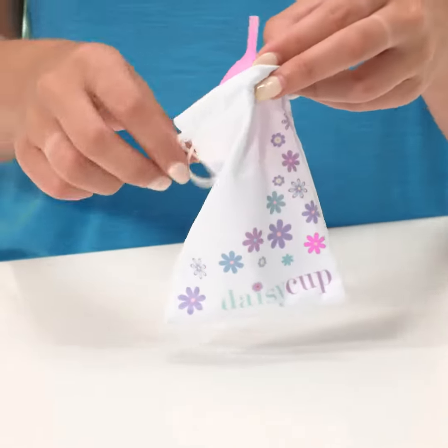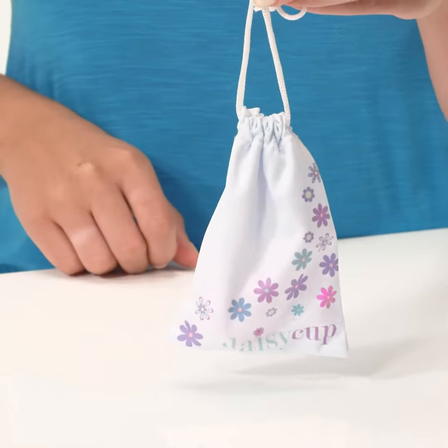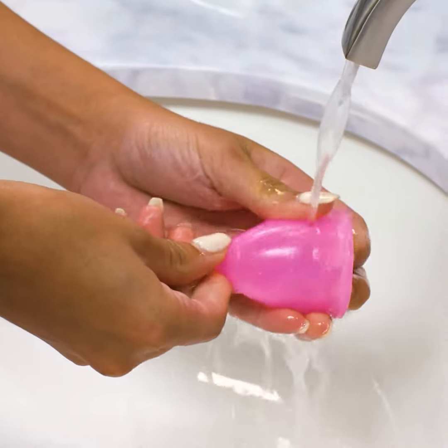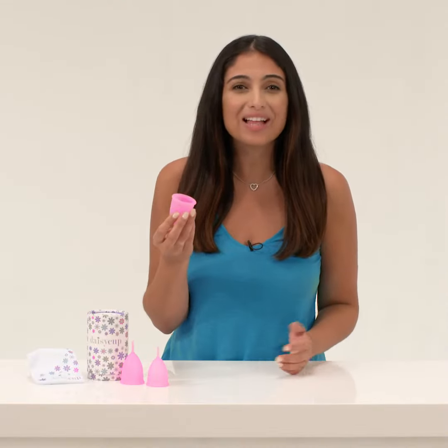When your period is over, store the cup in the drawstring bag included with your Daisy Cup. Before using it again, wash it with antibacterial soap that's free of perfumes. That's it. Daisy Cup is amazing, comfortable, and convenient.